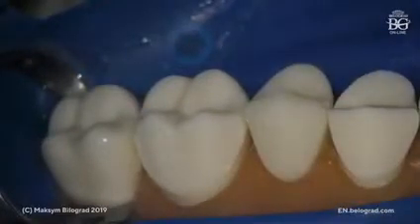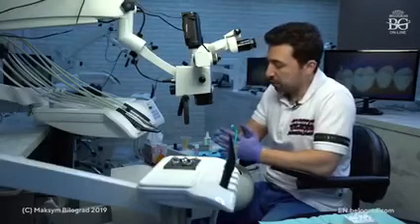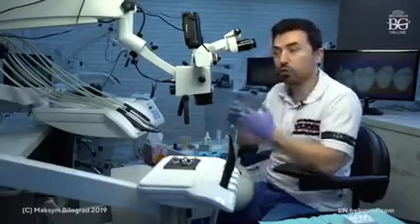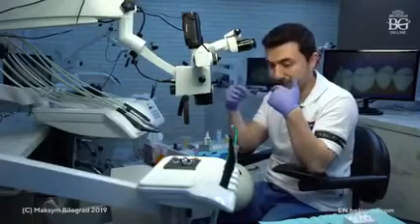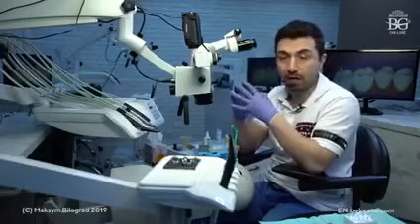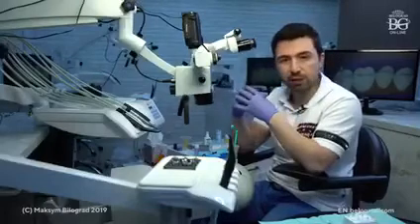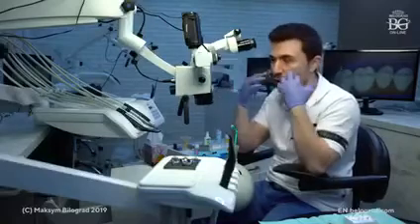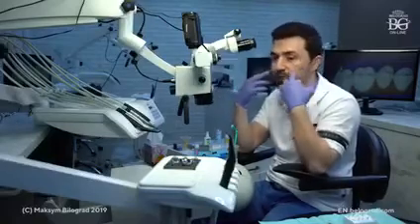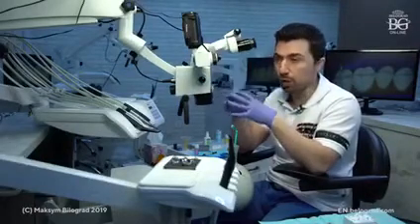That's why we call these easy money cases. You just need to change the color, and basically these kinds of preparations can be done on the upper jaw, because when you do a lower jaw aesthetic makeover, when the patient opens the mouth, you can see the occlusal surface. Just imagine you have a tooth of A4 color and you are doing BL3, for example, and you will see this occlusal surface, which is a pretty big contrast. So window prep is more for the upper jaw, for molar teeth, for premolar teeth, when you change the color but you are not doing anything from an occlusal perspective.